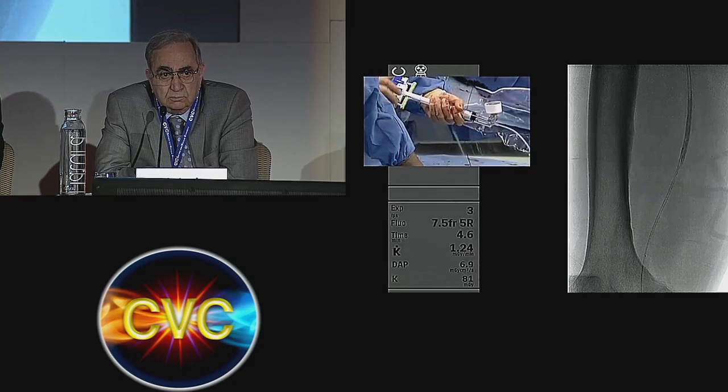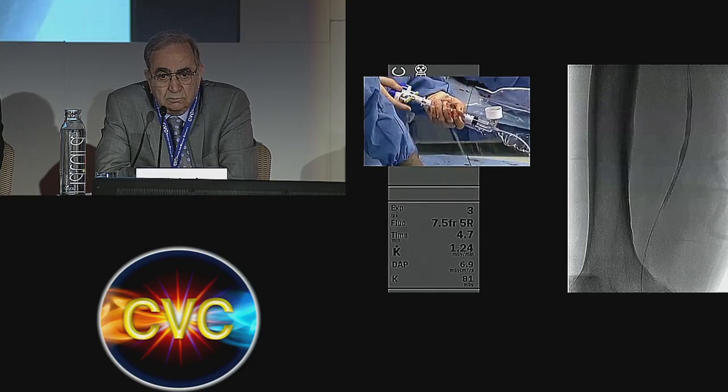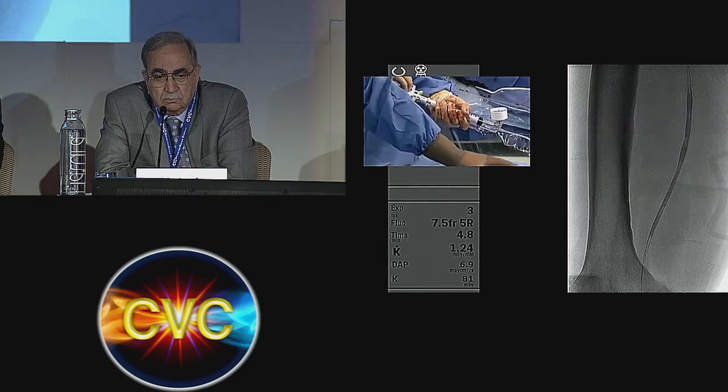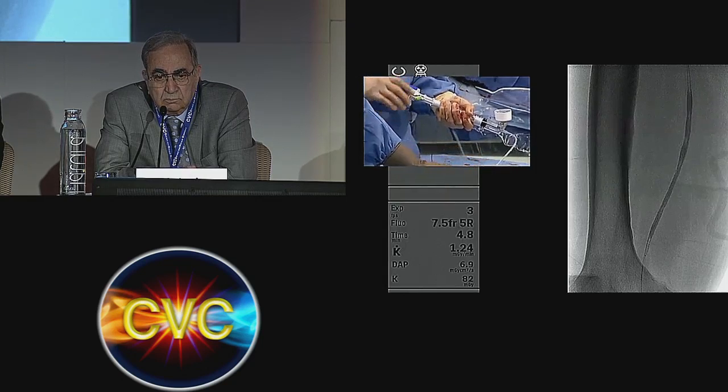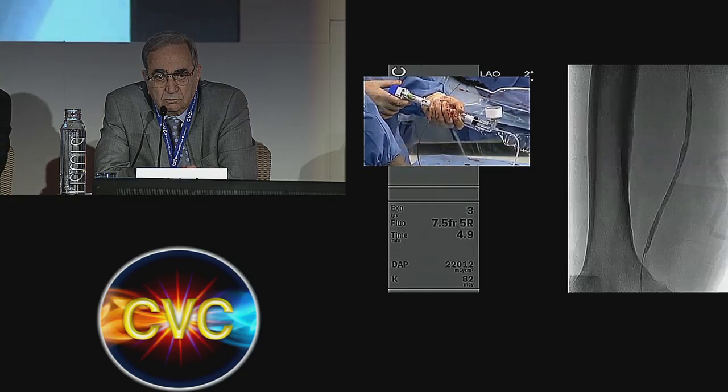You know, I'll say this, if this patient did not have tibial disease, I don't think he will be claudicant. I think this stenosis in the SFA is maybe moderate. And you can tell like the balloon is, I don't think treating the SFA is going to change his symptoms. I think this is a single vessel runoff, 99% occlusion in the proximal AT. If you don't open that AT, he's not going to get better.